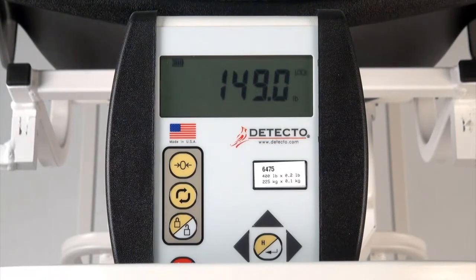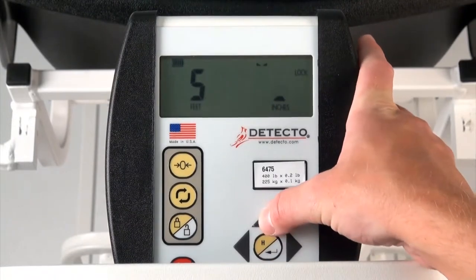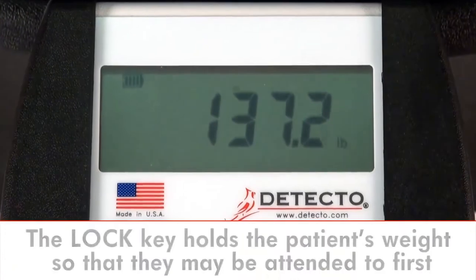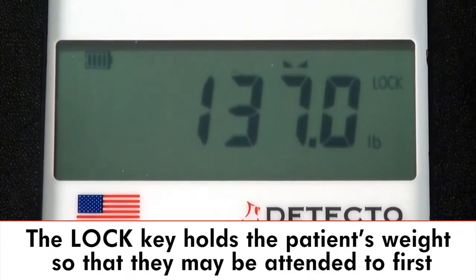Simply press the BMI/Enter key while weighing and then toggle up or down with the height arrow keys. When the patient's height is arrived at, simply press the center BMI/Enter key again for the patient's BMI readout. The scale's lock key holds the patient's weight, so the clinical professional may attend to their patient first before recording the weight.